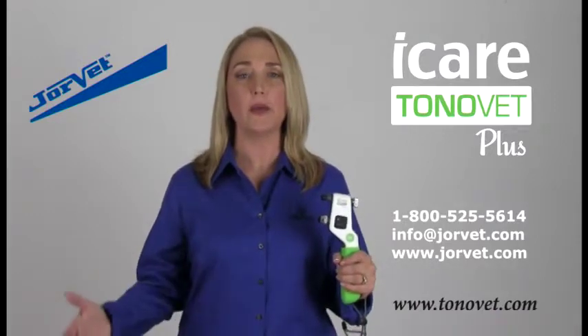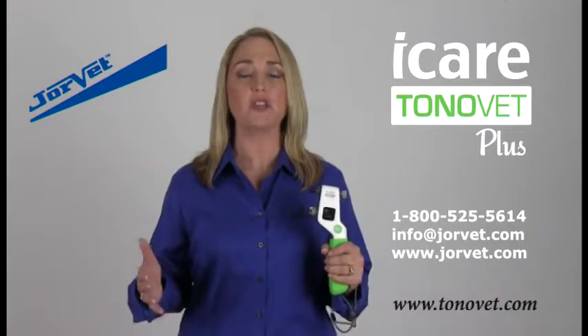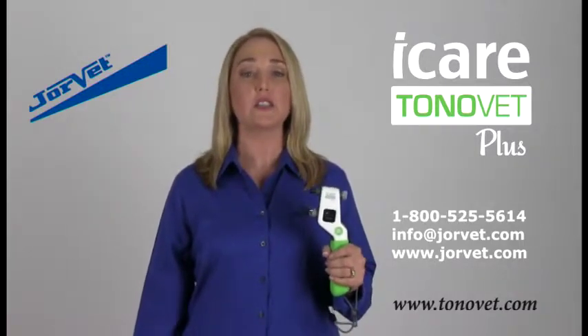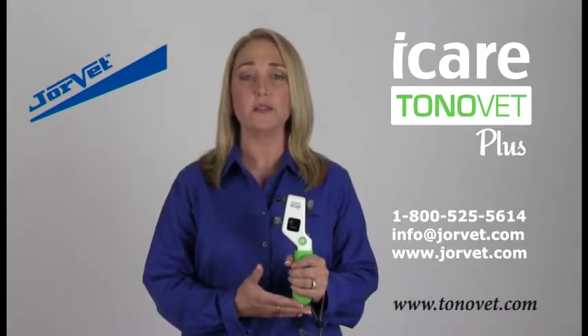As you can see, the new ToneVet Plus is quick, easy to learn and use, very accurate, and patient friendly. Let us show your clinic how to successfully measure IOP. Contact us today for a demonstration.